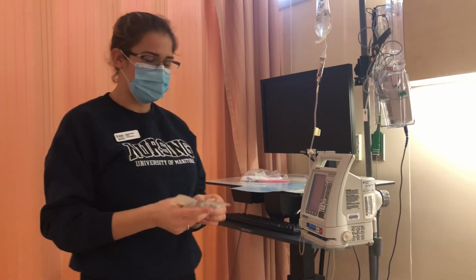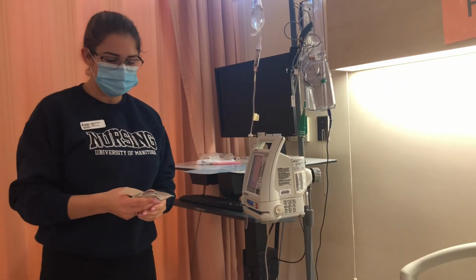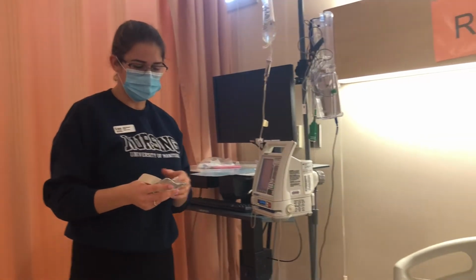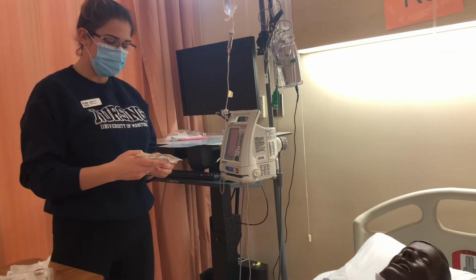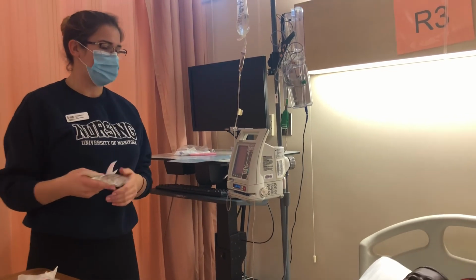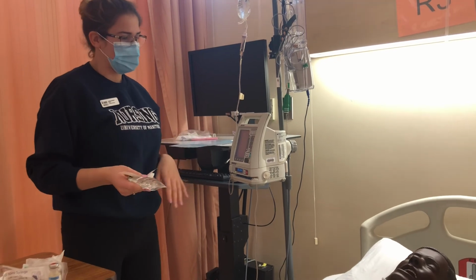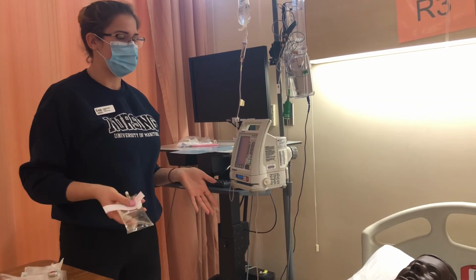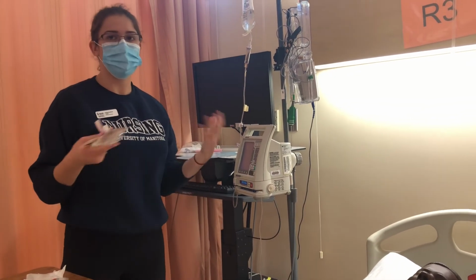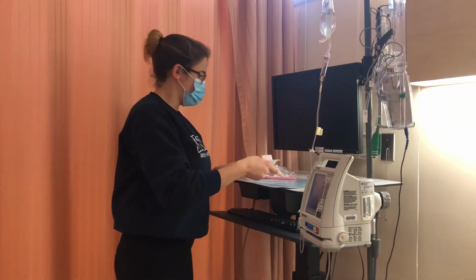So this drug is cloxacillin. It's indicated for your bacterial infection, cellulitis. So this will help clear up that bacterial infection. It's an antibiotic to help with that. So this drug may give you side effects such as diarrhea, nausea, or you may have an allergic reaction such as a rash. So we're going to be monitoring for those symptoms. If you have any of those symptoms, let us know about them. So I'm asking the patient if they're okay to take this drug, and they consent and say that they will. So we're good to set it up.